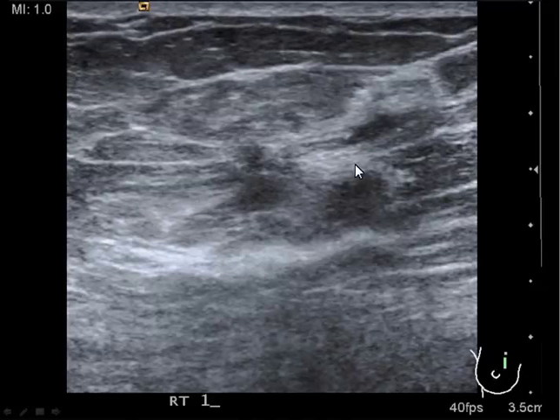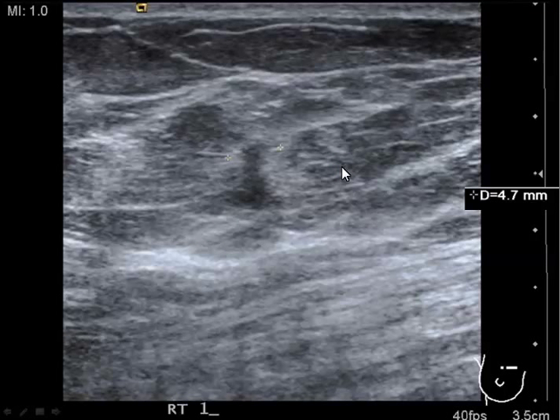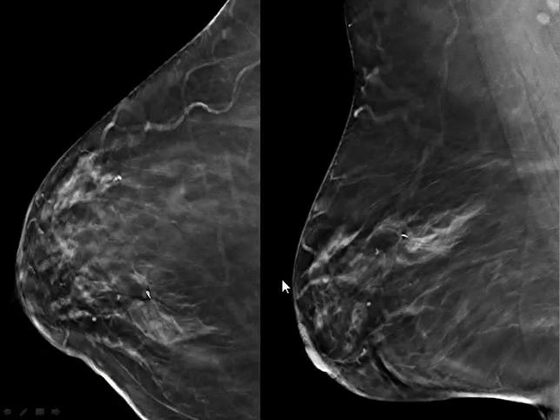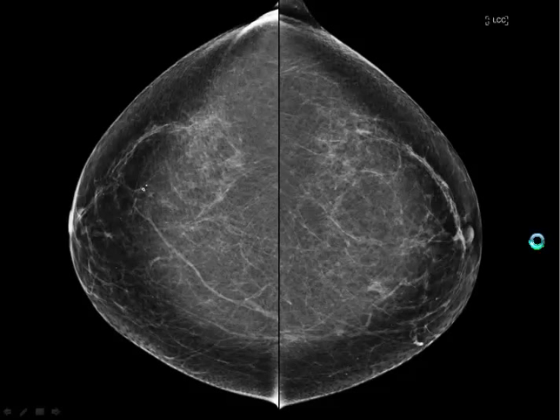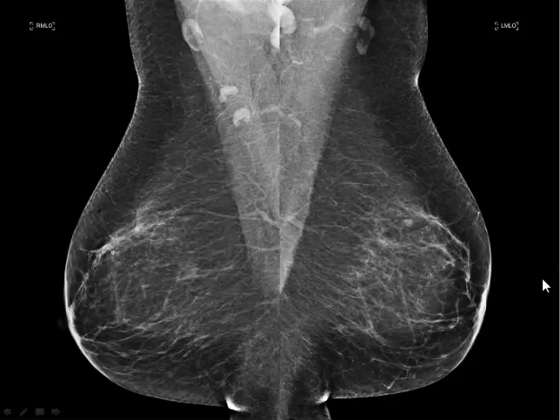I think I hear the jaws dropping as I'm talking about this — that's the reaction I get when presenting this to other physicians, and I can't blame them. There's the post-biopsy clip. I'm emphasizing the fatty replaced breast because that's not where we thought we'd see a lot of help from tomosynthesis. Actually, I almost prefer it in fatty replaced breasts because you can see very, very subtle lesions that would be difficult to see otherwise.